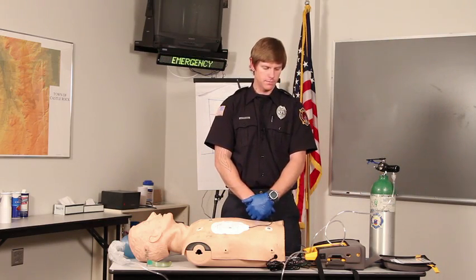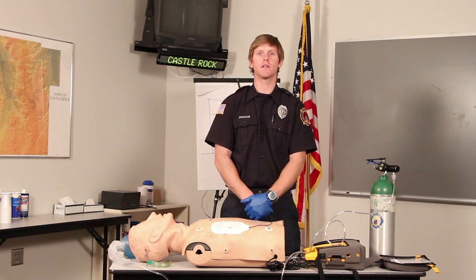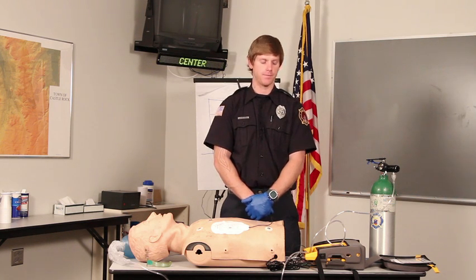Stand clear. The AED will prompt you to stand clear of the patient, and not only do you need to verbalize this for scenario, you need to make sure bystanders aren't touching the patient as well. Before you deliver any shock to patients, you want to also make sure that you and bystanders are clear of the patient before delivering any shock.